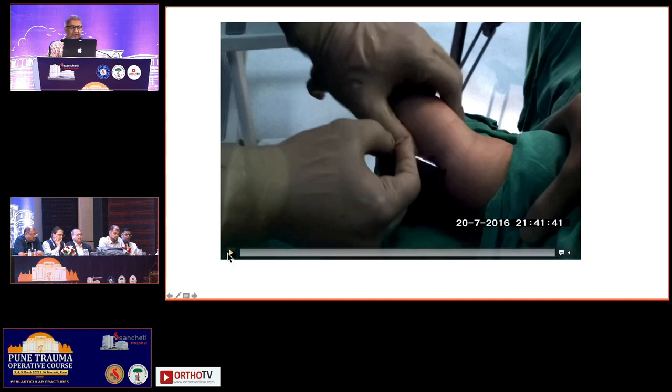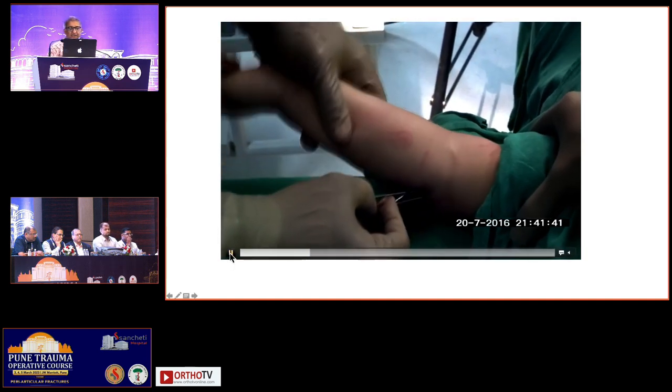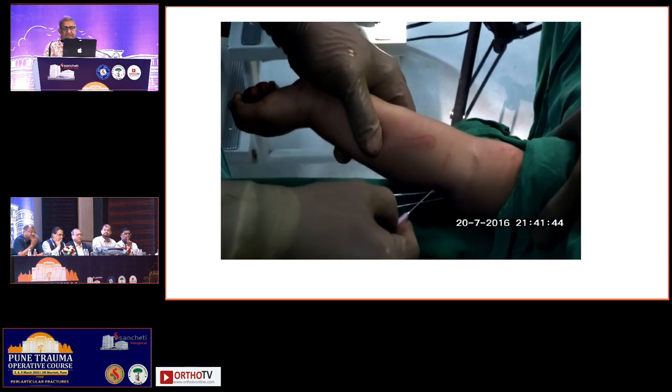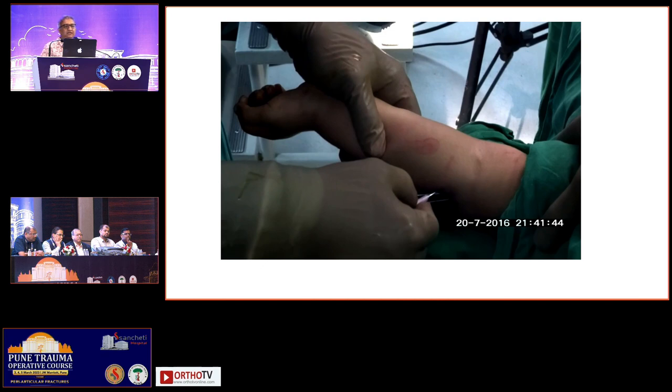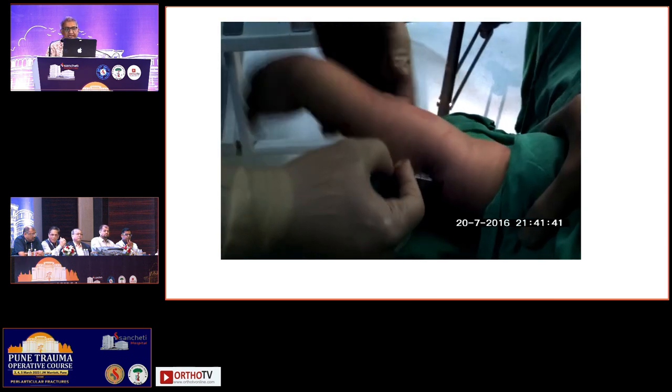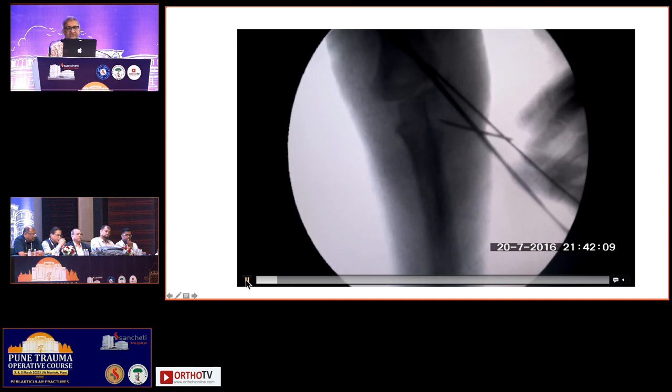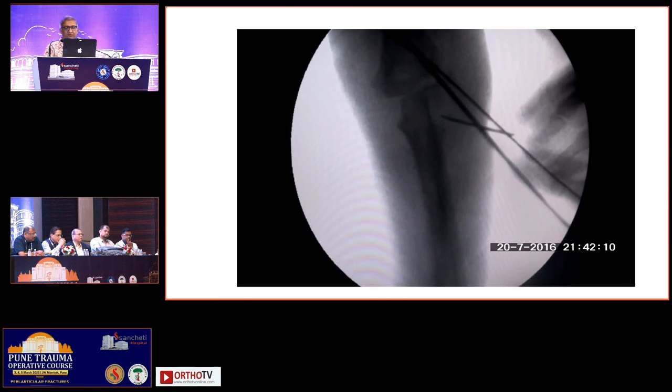This is how you do an arthrogram after this. You put in a needle from the lateral aspect just above the radial head. So this is putting the needle. As soon as you put the needle, since this is a fresh fracture, you will have hematoma. Initially, you can inject air. When you inject air, that will be confirmation, because if your needle is in a wrong place and if you put in dye, your entire view will be spoiled and your fixation will be in trouble. So first you inject air, and after injecting air, then you put dye, and this is how you are putting dye.